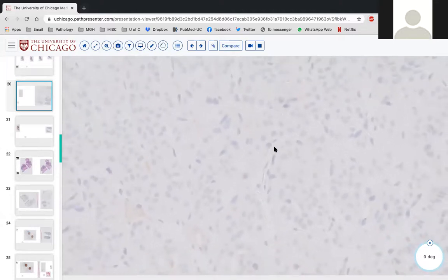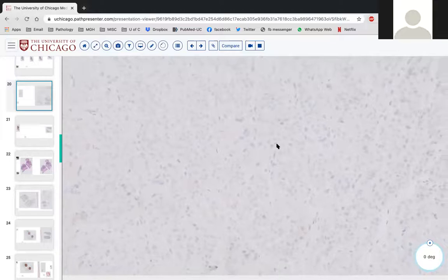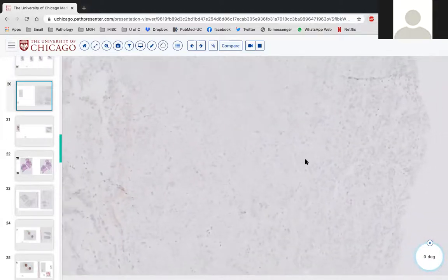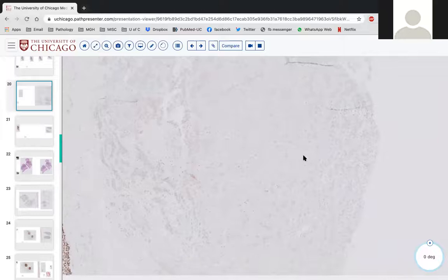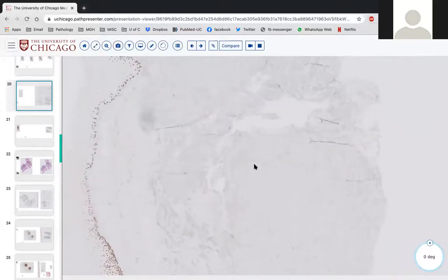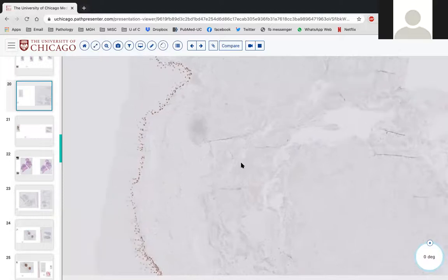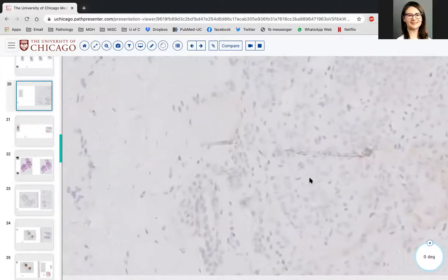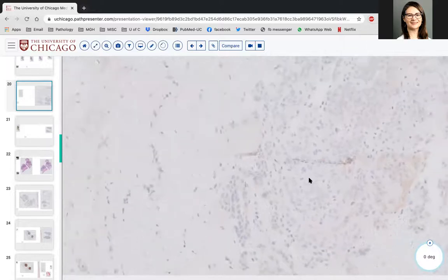You know what? Then this cannot be... Okay, so if it was intraductal and we had super strong and diffuse S100, which we did, but P40 at the periphery of this lesion, definitely dead negative, so maybe I can rule that out. I don't know. Think about that. I think I have a table of strongly S100 positive tumors.